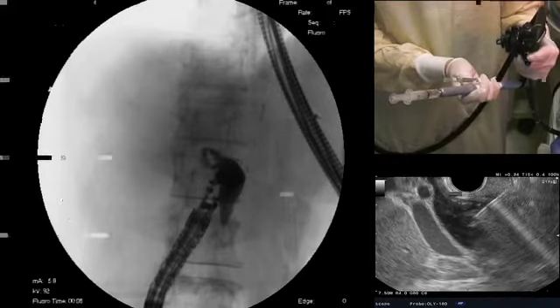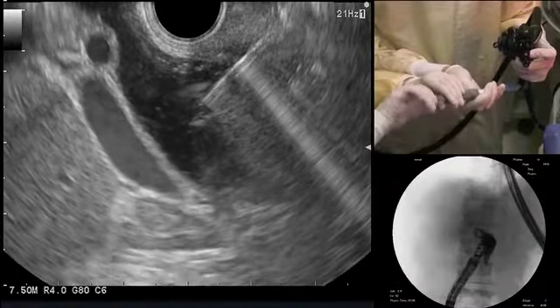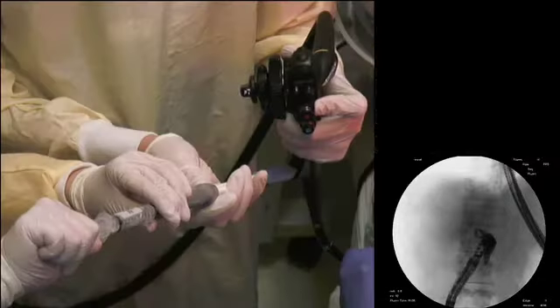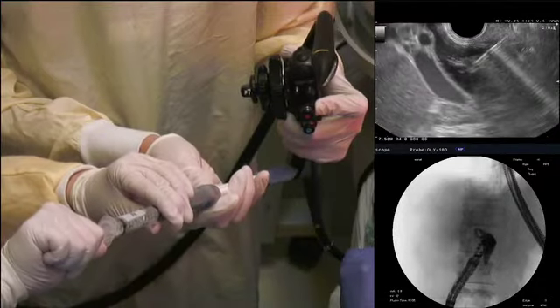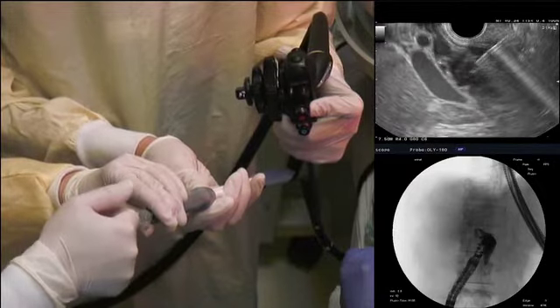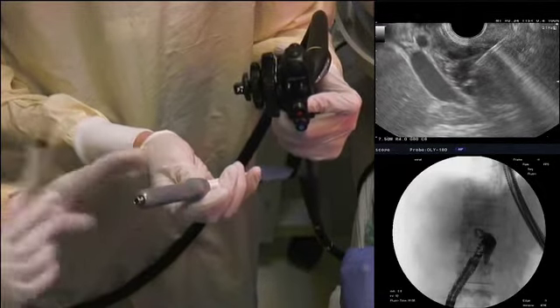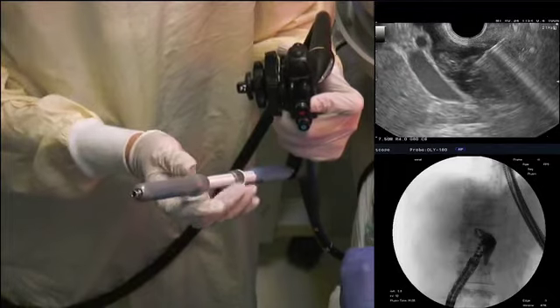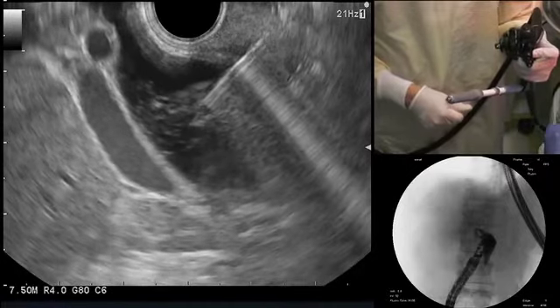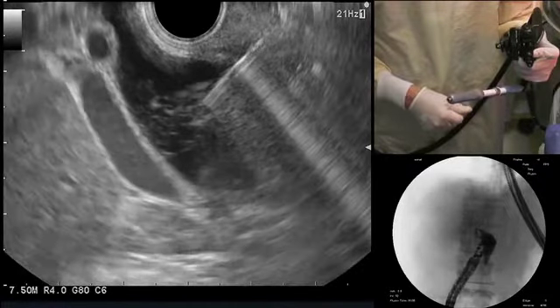So now we're ready to put our guide wire in. I'm going to aspirate back, put some water so it's not sticky. Jeannie is flushing the needle with some water because the bile is very sticky. Now we have water going into the bile duct — we see that very nicely on the EUS. Now we're going to pass our super stiff wire into the bile duct.